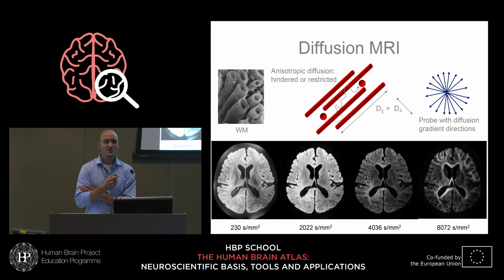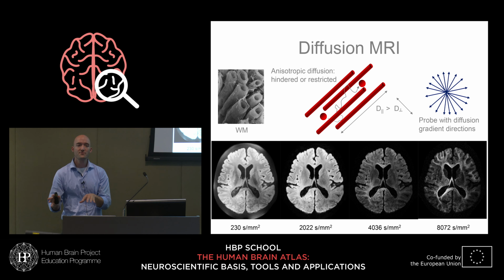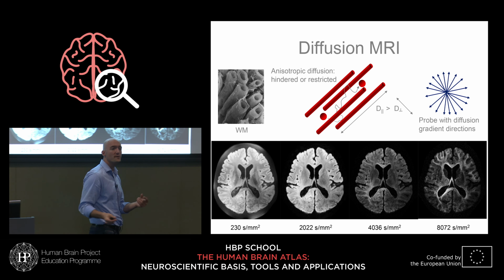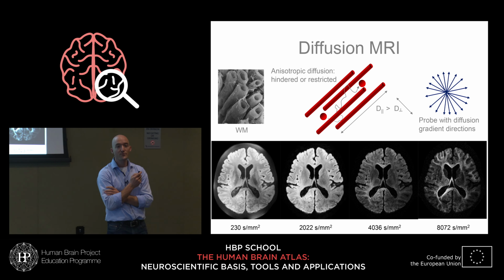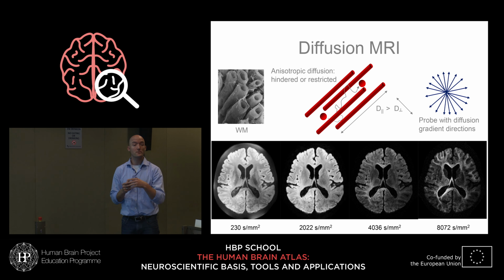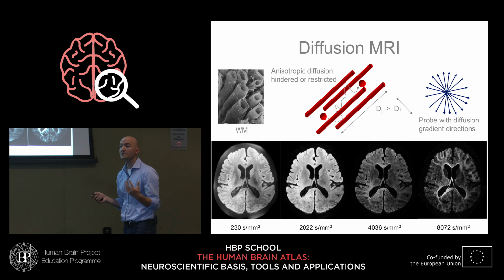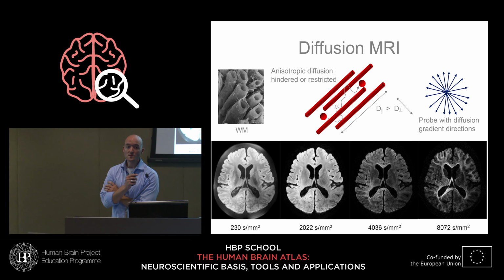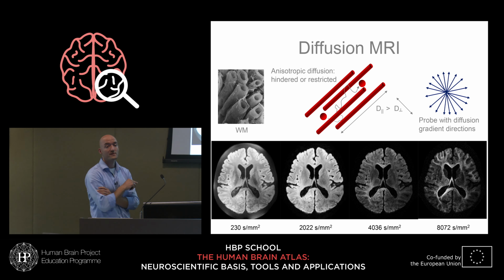Yeah, so again, I'm taking the liberty to give you my brief one-slide recap about what diffusion MRI is, because I do assume that you know something about it already. In diffusion MRI, we look at nothing else than the diffusion of water. The passive motion of water, the thermal motion of water, Brownian motion, right, as it's known. If it's not ice, the water molecules will randomly walk around. And when they do so, they will bounce into things.